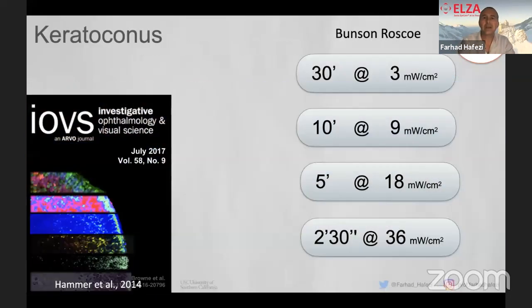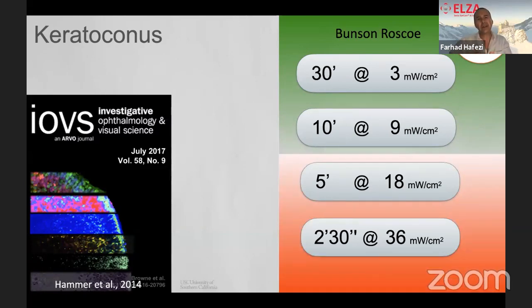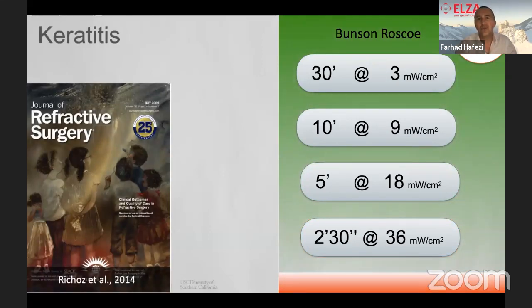You may know that if we look at keratoconus, we can accelerate in a certain range. Our group published the oxygen data and published accelerated cross-linking. And we saw that a moderate acceleration from 30 minutes to 10 minutes, yes, that works for keratoconus. We cannot go faster because of oxygen limitations, but we did the same thing for infections a few years ago. And here you can go faster. You can go to 150 seconds, 2.5 minutes with very high intensity without losing efficacy. We published this 6 years ago already. Why? Oxygen independent, partially independent. So at least within this range of intensities, yes, you can go very fast.